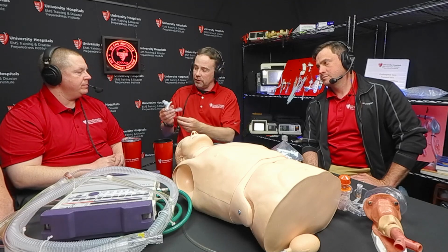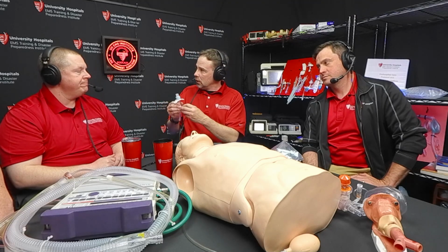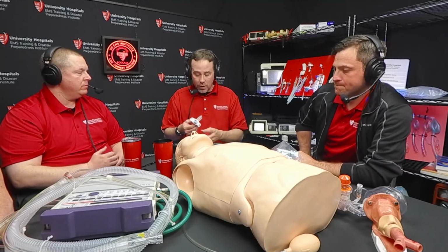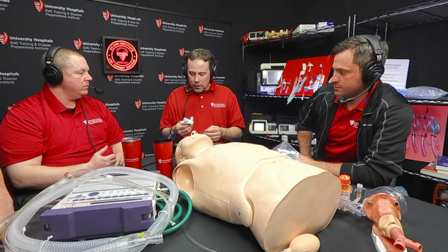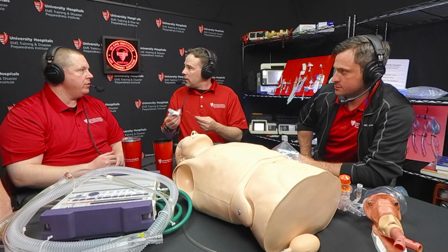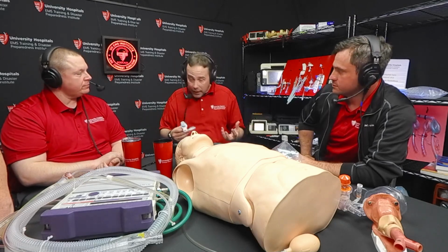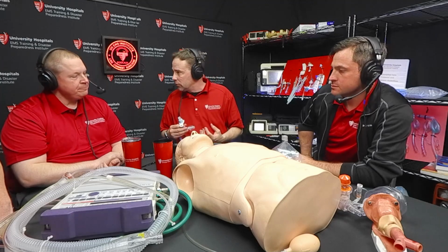And I've had a couple of cases where that distal cuff was torn or damaged or otherwise leaking. Who knows why? And then you just replace the entire unit. It was just like, hey, respiratory, do you have another one? And we're going to help you replace this real quick.